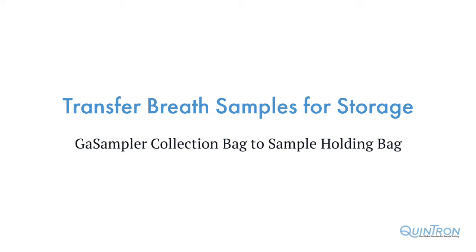In this tutorial, we will demonstrate how to transfer a breath sample from the gas sampler collection bag to the sample holding bag for longer term storage.